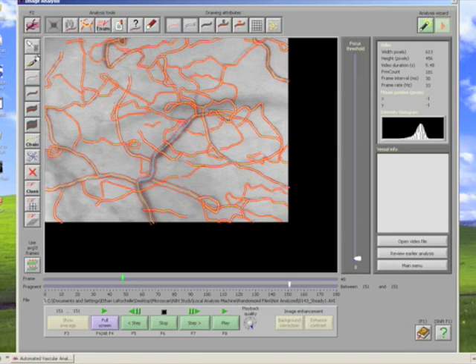Cutting a vessel will divide it into two vessels. You can also delete vessels, or undo a delete by holding the Shift key. Using the chain tool, you can combine two vessels together. With all the vessels drawn, we can begin our flow analysis.